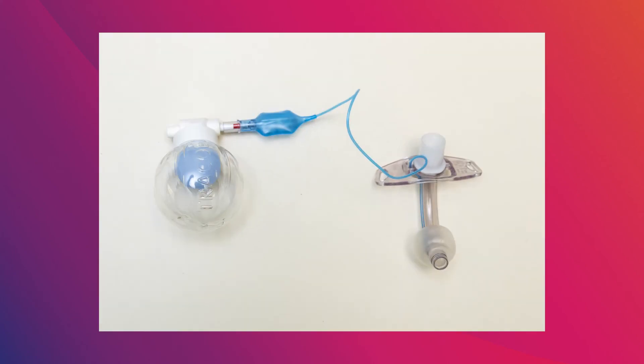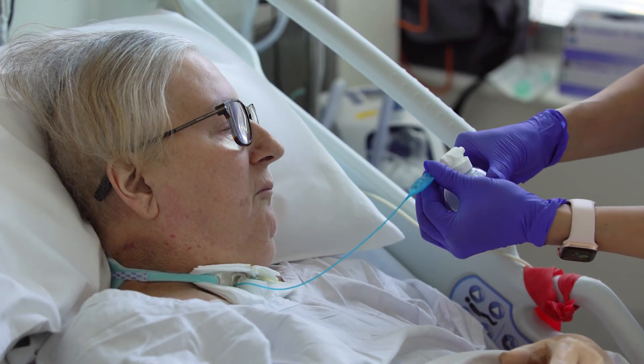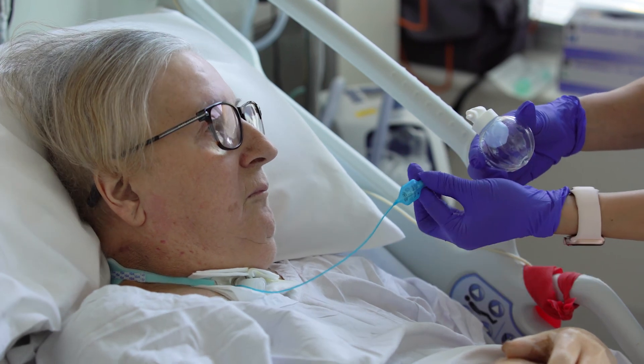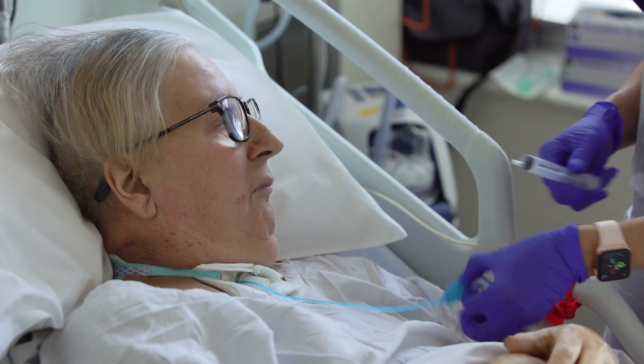This is an example of an underinflated chamber balloon. This is an example of an overinflated chamber balloon. If the device is detached, the chamber balloon will deflate. The tracheostomy cuff will however remain inflated. To deflate the tracheostomy cuff, you must use a 10ml syringe.